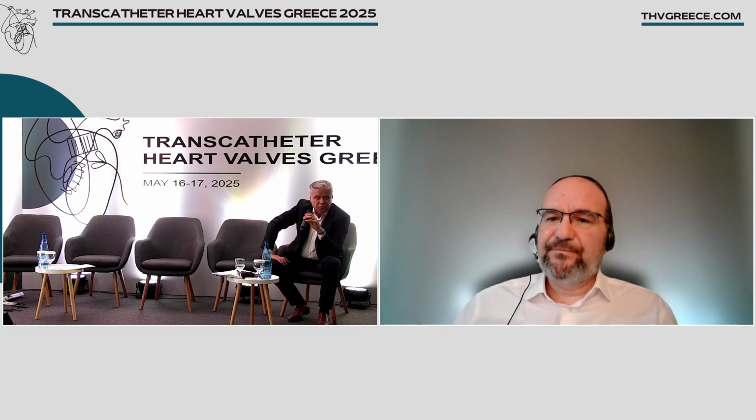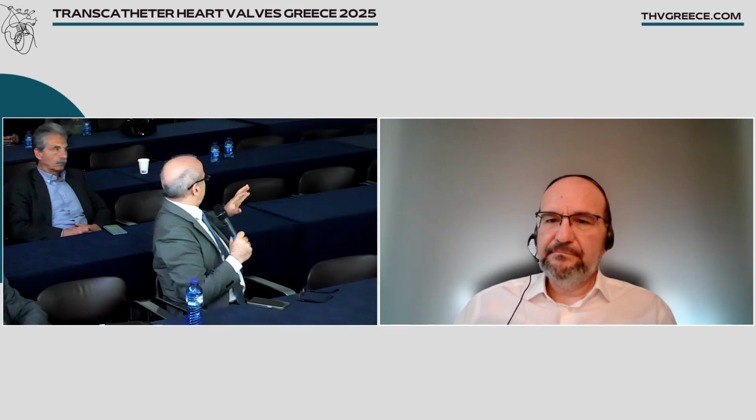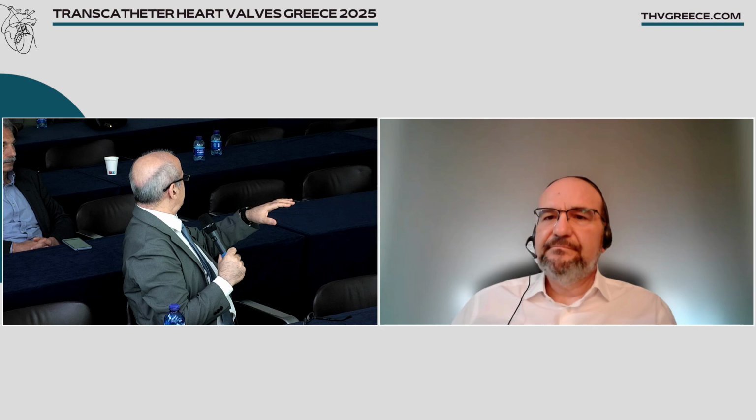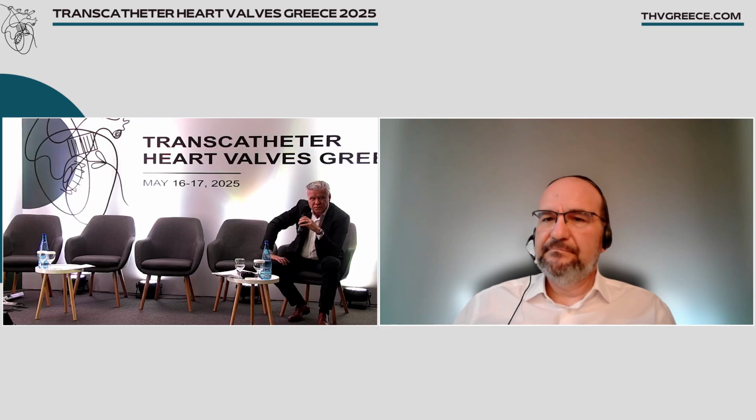Just a comment from me, a word of caution. You're absolutely right, because in all your planning, if the valve was going at the STJ or above, there will definitely be an obstruction. And I think a coronary angiogram at that stage, Michael, might fool you. You might see some flow into that left sinus of Valsalva and say, oh, I don't see a stenosis. But this flow certainly will be low flow, low velocity flow, so you'll transform an aortic area into a venous area. And this will be high risk of thrombosis and then embolism in the coronaries.